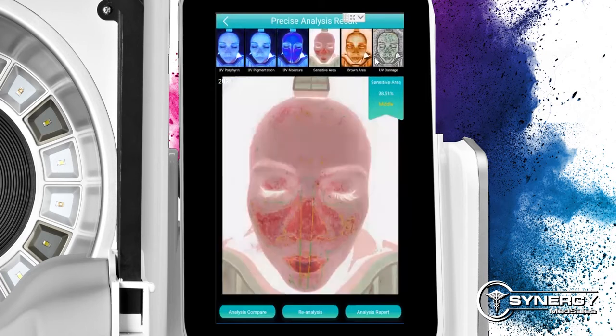Now we get into what you can't see with the naked eye. We have sensitive areas. So this is where her barrier is broken down, where her skin is more compromised. You'll see these darker red areas. I like to think of this as where the ice is thin. If we were ice skating on her face, where you need to stay away from, you might fall through. So this is going to be great if you have that patient who's been on active product and they forgot to stop using it before they came to you for treatment. This is great.